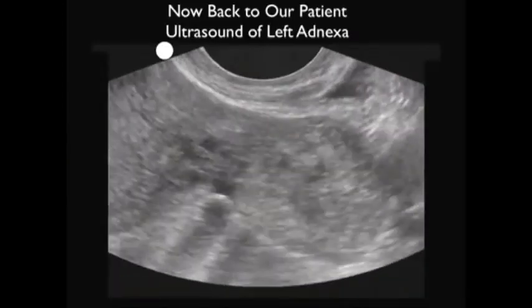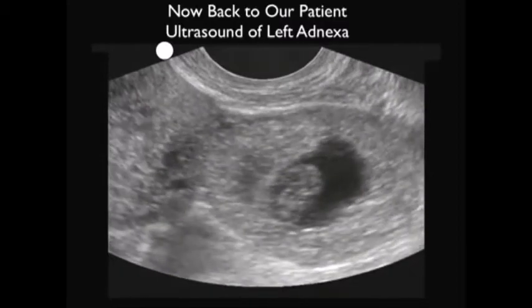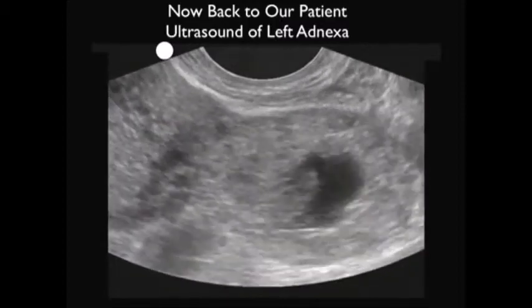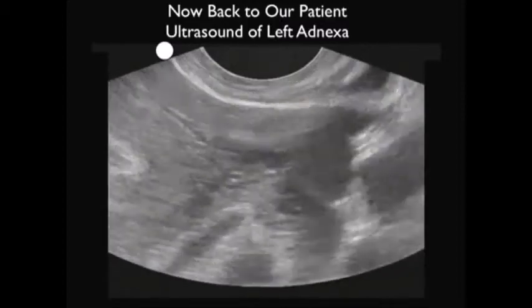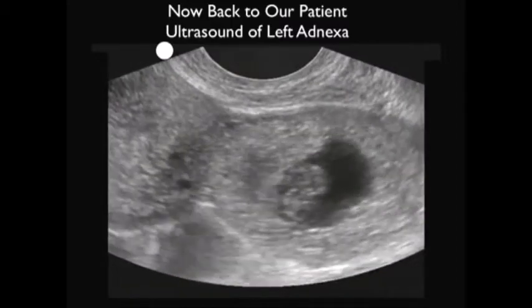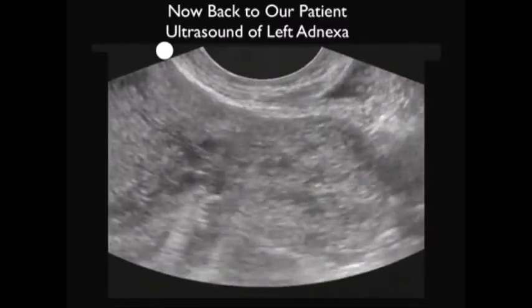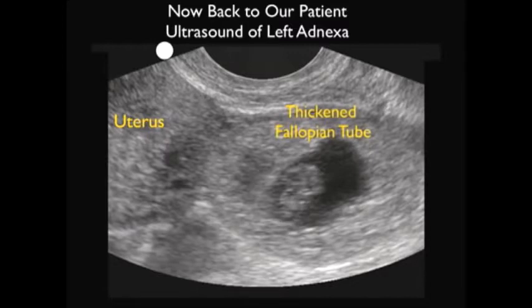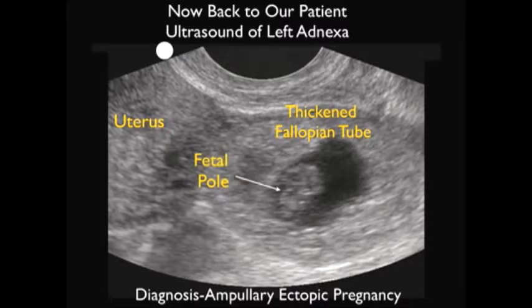So here are the sonographic findings to wrap up the conclusion of the case. Here we're scanning out from the midline uterus, as shown there, out towards the left adnexa. Notice in the left adnexa a positive finding. We see here a thickened fallopian tube, or a bagel. And let's look inside the bagel. What we see there is the presence of a fetal pole. So we'll go ahead and still that down, and we see again the uterus towards the midline, the thickened fallopian tube out towards the left adnexal region, and within the thickened fallopian tube, the presence of a fetal pole, making the diagnosis of an ampullary ectopic pregnancy.